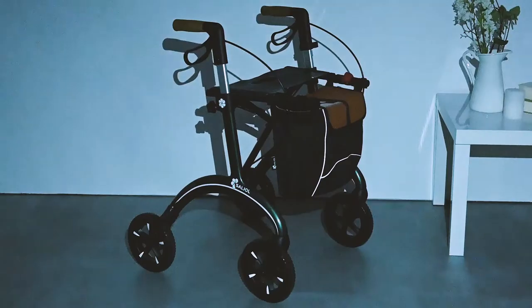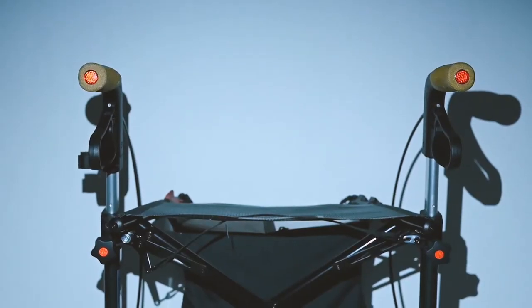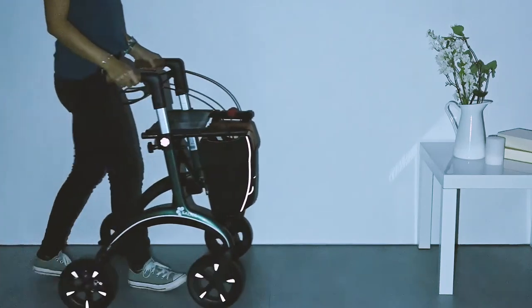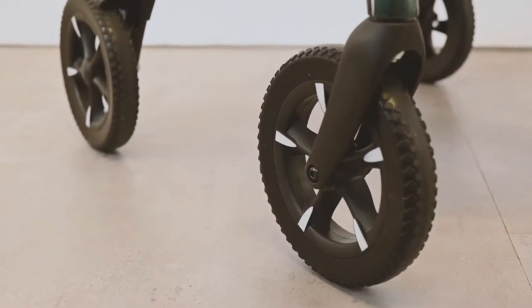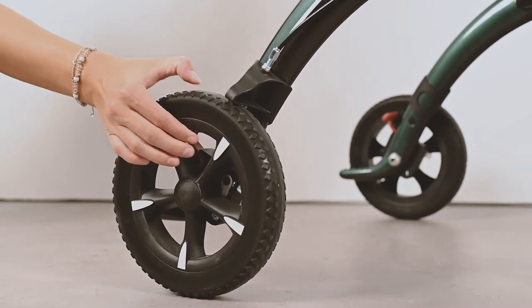Safety is a top priority for us. For your safety in the dark, we have attached a lot of reflectors to our rollator.